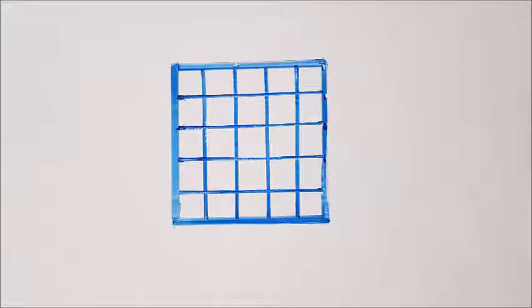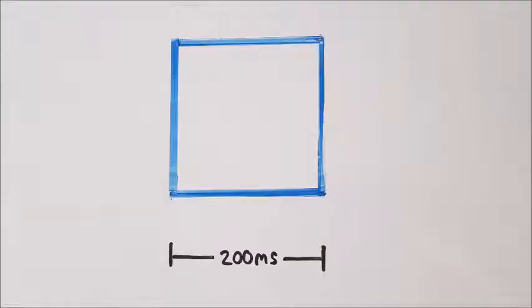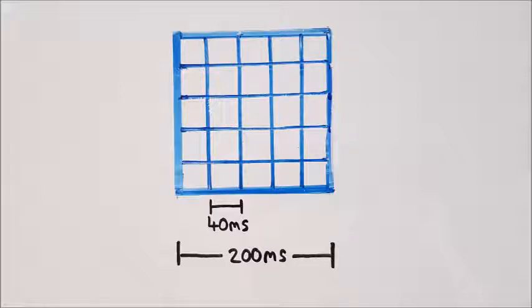So after talking about intervals, we would want to be able to accurately measure them. ECG paper is essentially graph paper, and although it can be changed, the width of a large square normally represents 200 milliseconds. The large square is then further divided into 5 smaller squares that therefore represent 40 milliseconds each.